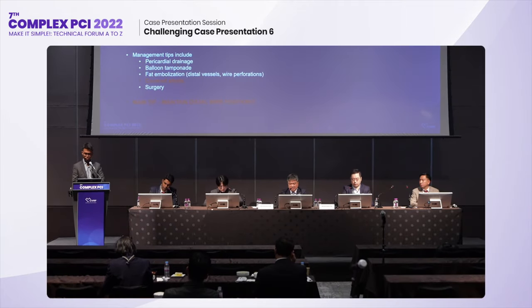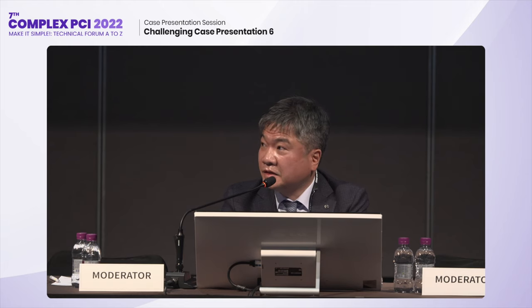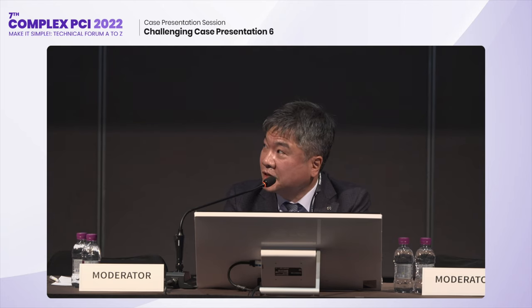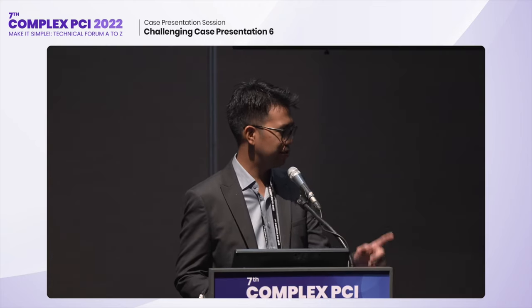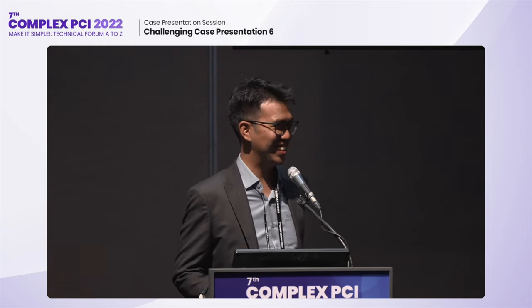Thank you very much. No, congratulations on your wonderful procedure after the big coronary perforation. So I have several questions or comments. If I see the pre-procedural coronary angiogram, it's a very small size vessel. Yes, yes. If next time, do you think it's really needed to be recanalized in distal LAD? I think in retrospect, I wouldn't have chased the distal LAD. In fact, after I had put the covered stents, I lost all the septal branches of that distal LAD, actually.